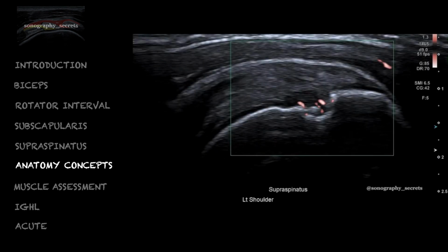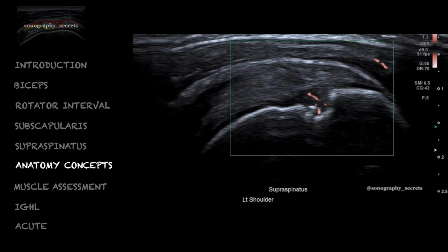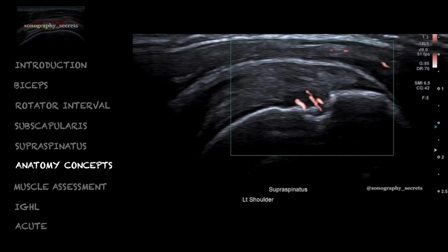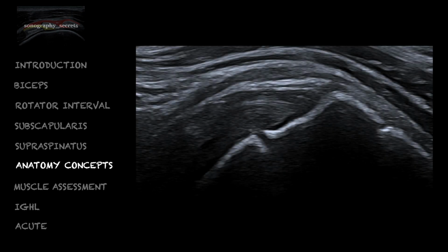As I said before, if we have an unhealthy enthesis, we'll have an unhealthy tendon, and we can use a low-flow Doppler or SMI to prove this. Vessels should not cross the enthesis, and if we do see vessels that cross the enthesis, these are pathological. This image here is not cortical irregularity, nor is it enthesis irregularity. This is a normal finding.